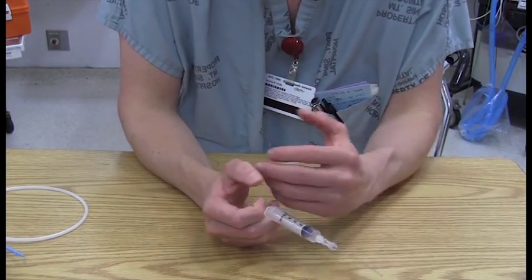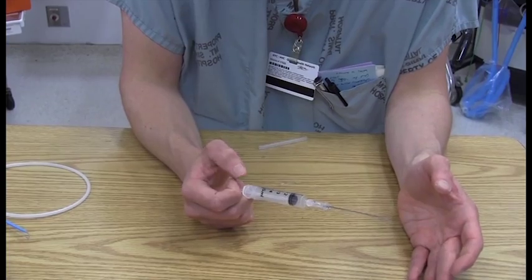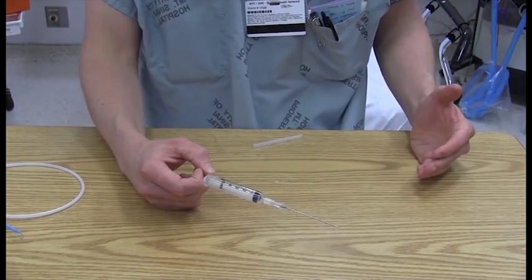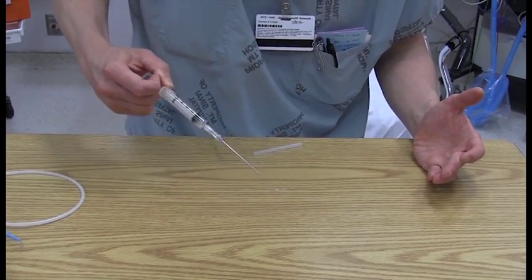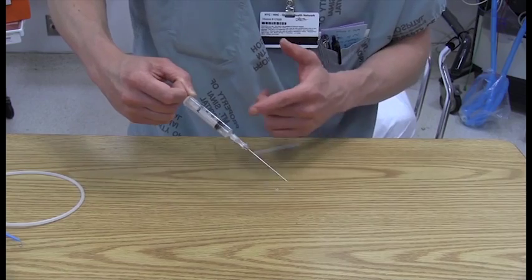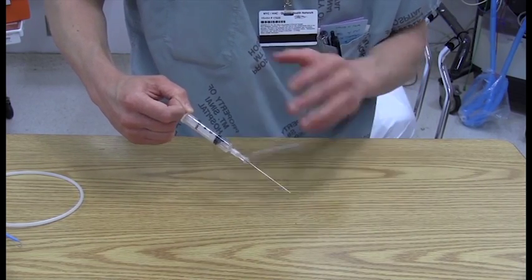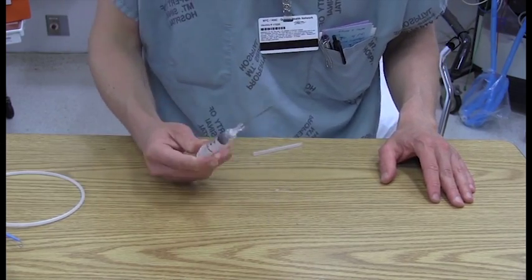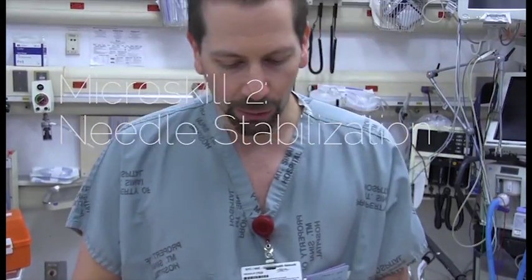Now, when you don't have it in anything, it's going to be consistently pulling back, which is not what you want. So what's a fun way to try this is you get an orange or something and just pop it in there and just practice moving in and out while trying to exert negative pressure on the plunger. And you have to be getting to the point where that's not going to occlude your ability to manipulate the needle location. So that's micro skill 1. All right. Micro skill 2, and this is really the important one.